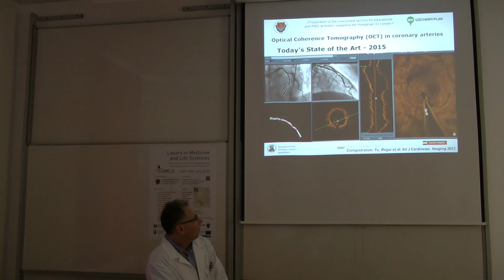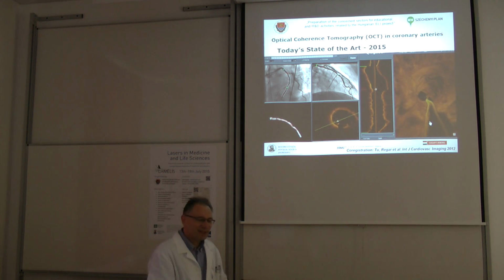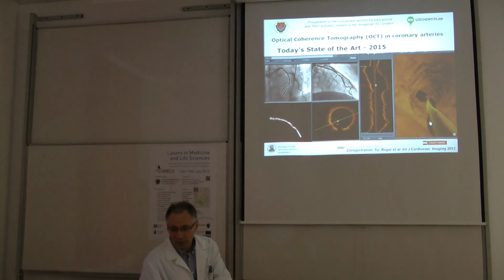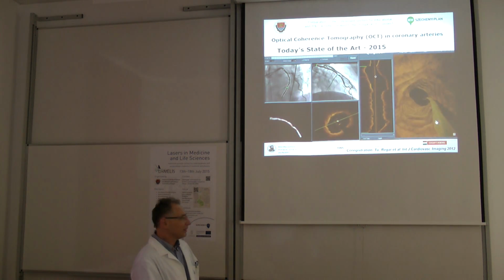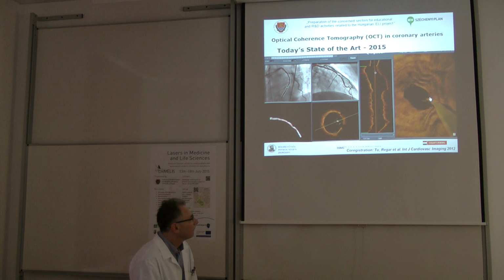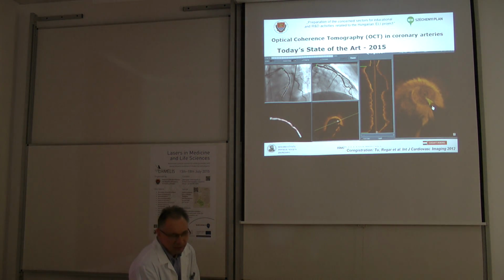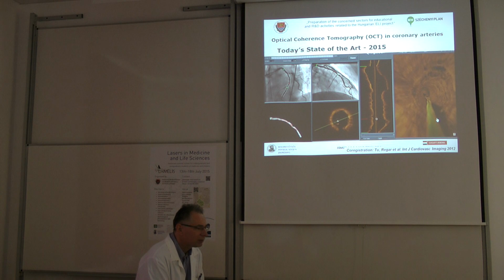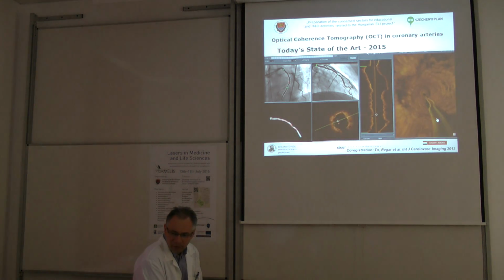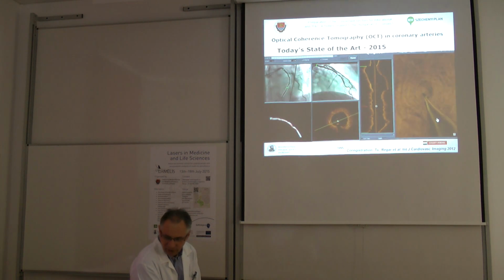So this is existing in our body? No. This is the guide wire that we temporarily push down in place. Okay, sorry for that. So this is not fiber? No, that is metal. This is stainless steel. Very thin, but you need it for the other images. Whatever we do with the coronary arteries, we need this wire inside.